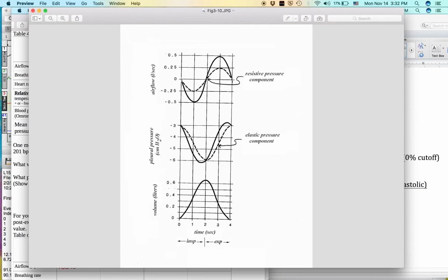Liters per second, so this is a rate. We can see that after we inhale, we stop for a minute and we begin the exhale process. So here we hit 0 liters per second. As you switch between inhaling and exhaling, or inspiring and expiring, we approach 0 as our rate for liters per second.